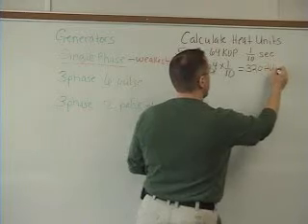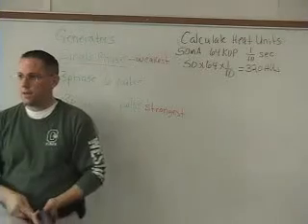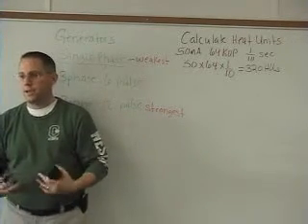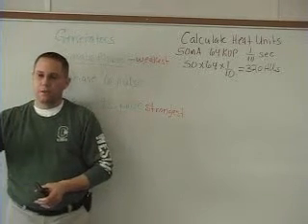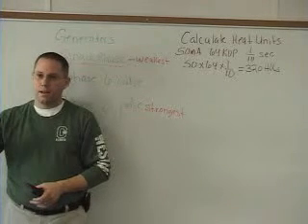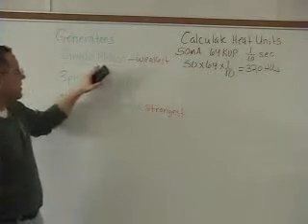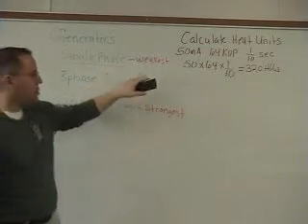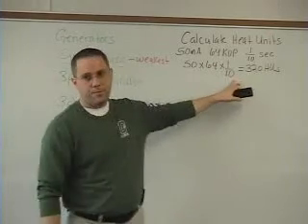You just put HU, heat units. It's not really degrees, it's just called heat units. So we know for that X-ray we're producing 320 heat units. Your machine will have a maximum amount that you can go. Let's say, for example, it was 5,000 heat units. You just don't want to go over that. Now, it depends on what type of generator you have. When it's a single-phase generator, you just multiply the mA times the kVp times the time.